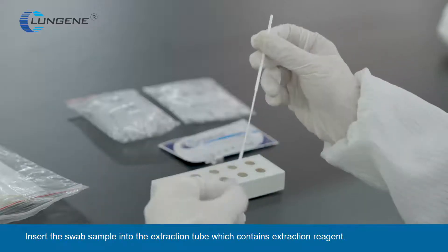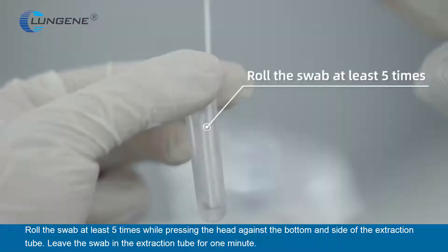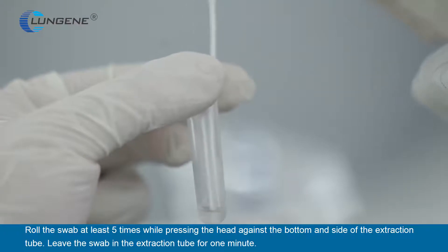Insert the swab sample into the extraction tube which contains the extraction reagent. Roll the swab at least five times while pressing the head against the bottom or side of the extraction tube.